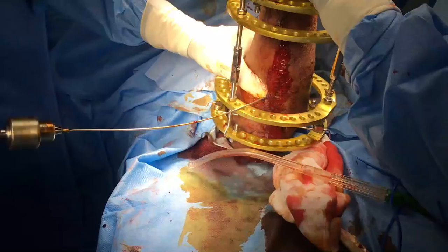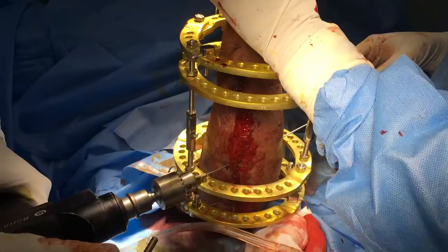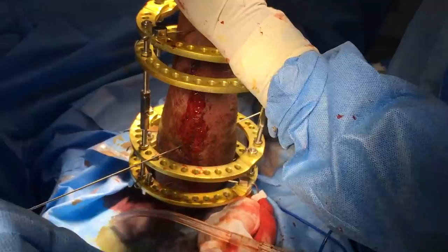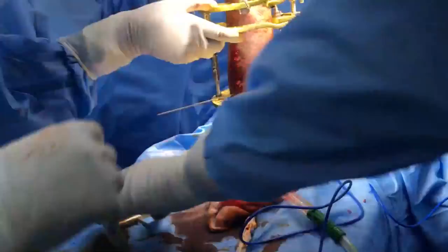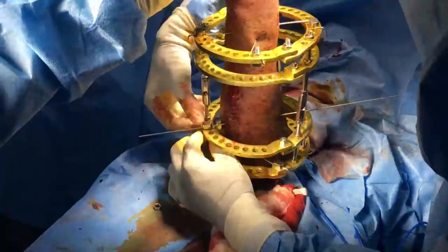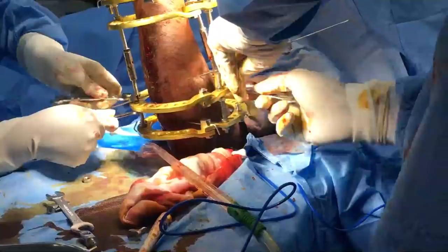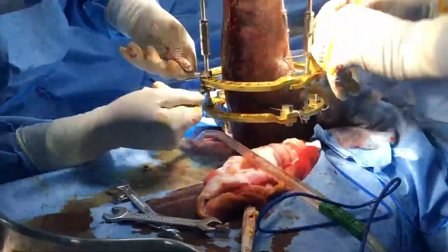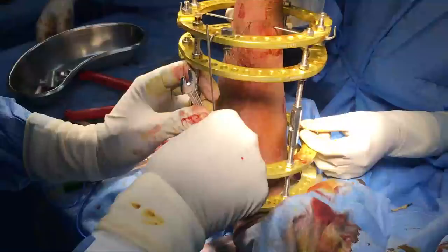The wires in the middle two rings will come after the olive wire, which will be used to buttress, compress, and bring together the loose fragments of the ulna that have been displaced because of the plate failure. The olive is pulled on the opposite side. The fracture is brought into place, and once again this olive wire is tensioned on the non-olive side to pull it tight and get it into place and alignment.